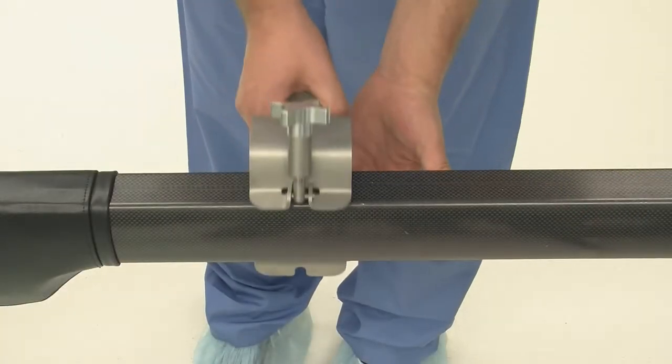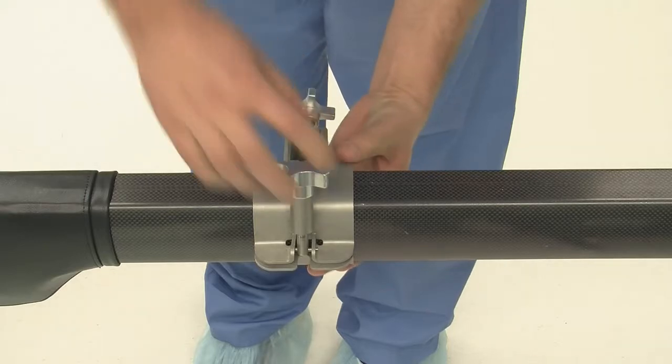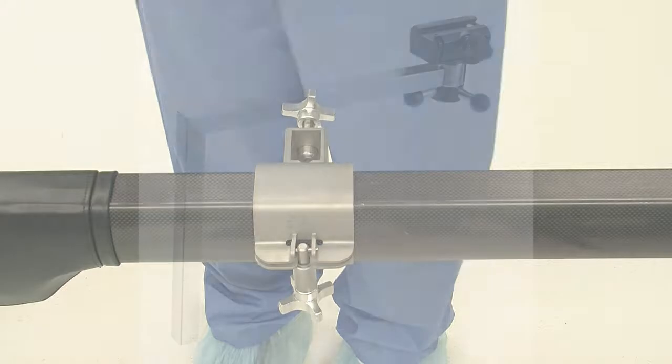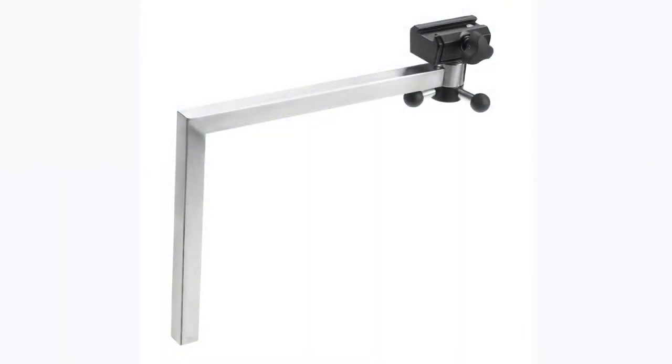First, you will need to add the spar accessory clamp to the spar and tighten. Next, insert the L-bracket into the accessory clamp and tighten.